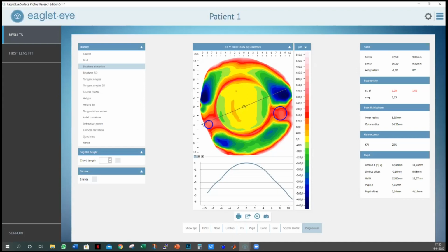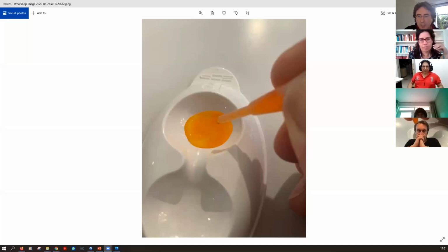We're nearing the end of our user forum webinar, but as right at the start, there was an interesting discussion with Brian Tompkins. He was so extremely kind to share on the Eaglet's Nest, our Facebook forum, a video that he made together with Keir Patel, about his best practice method for hygienically getting the best fluorescein onto the tear film. I have a still from the video to illustrate, and perhaps Brian, if you could talk through what you're doing. And of course, we all recommend that you go and watch the video itself. I think it's very illustrative. But Brian, if you could just talk us through it, please.